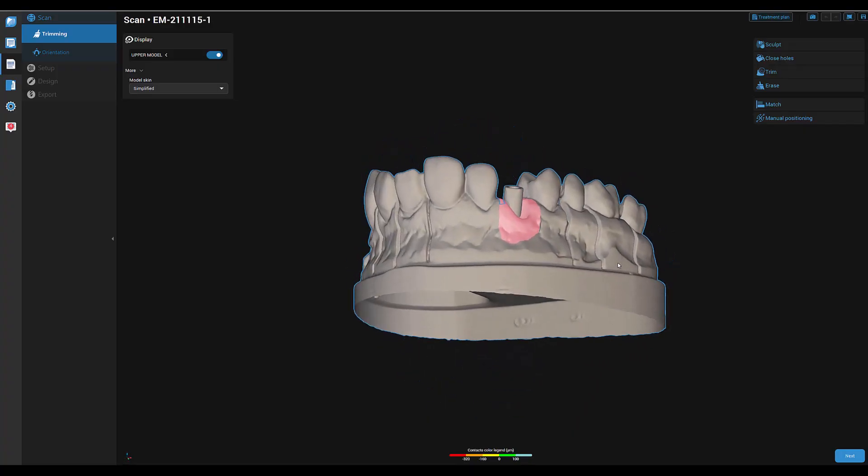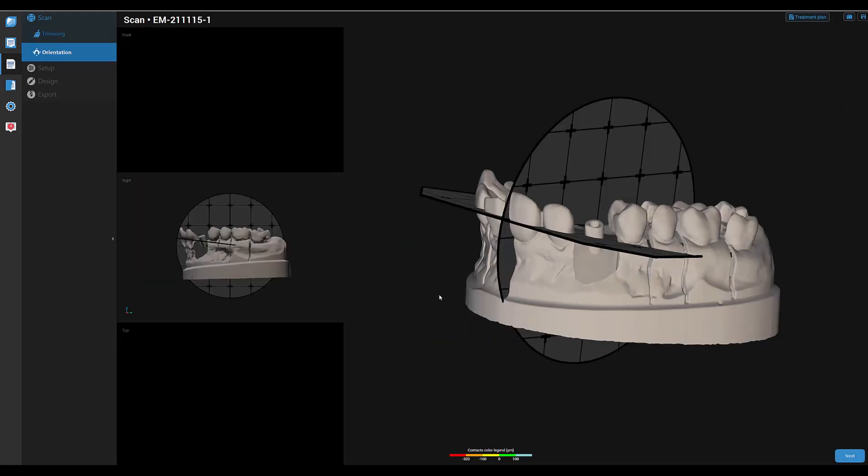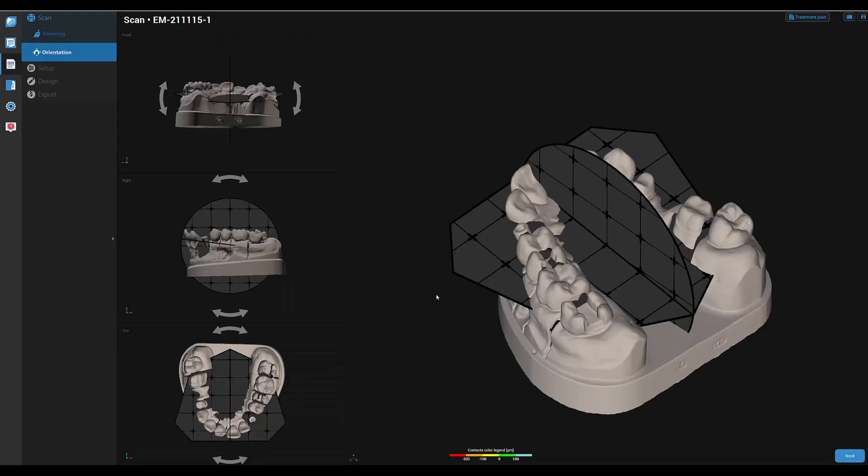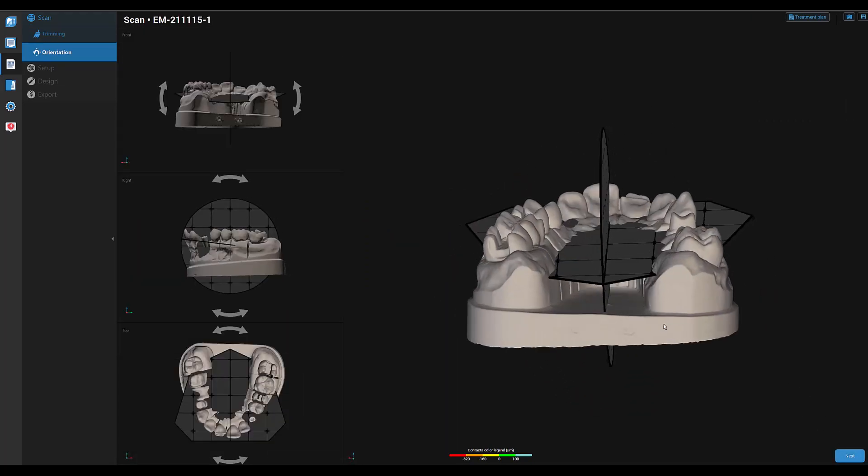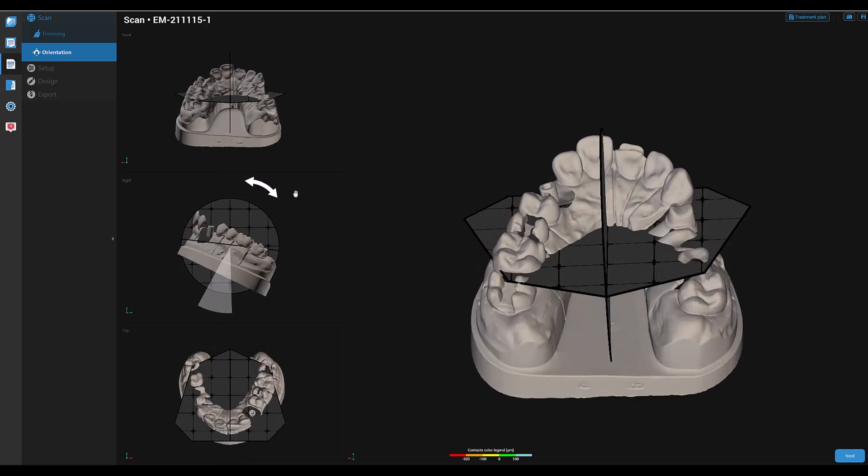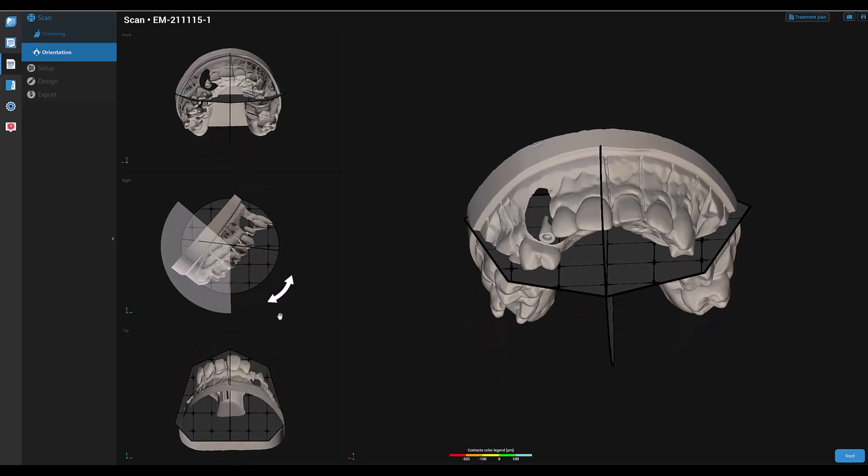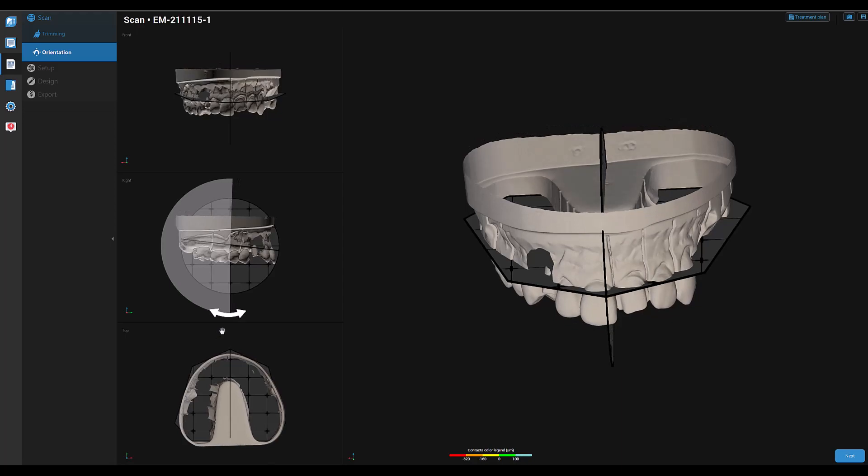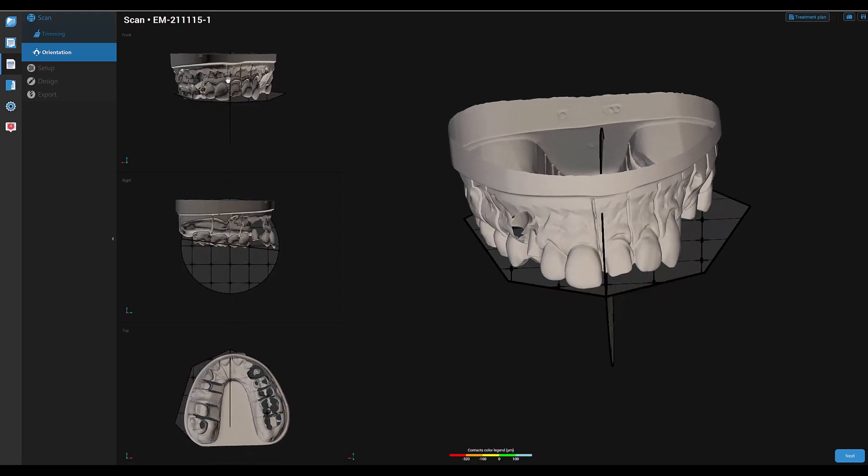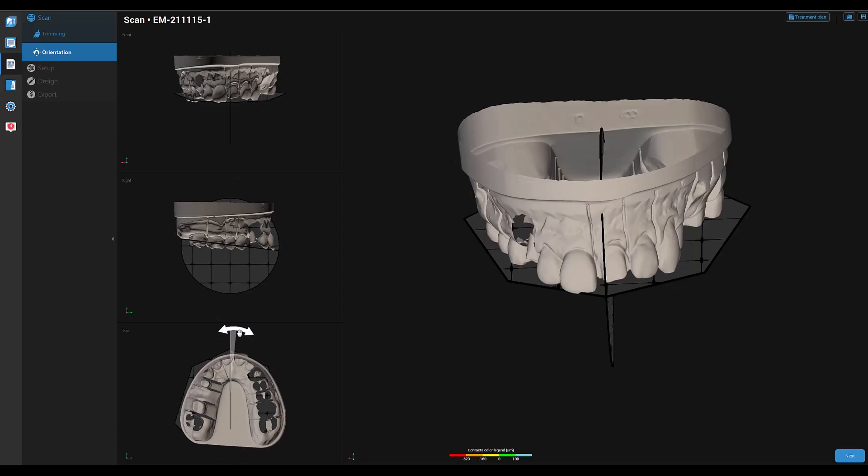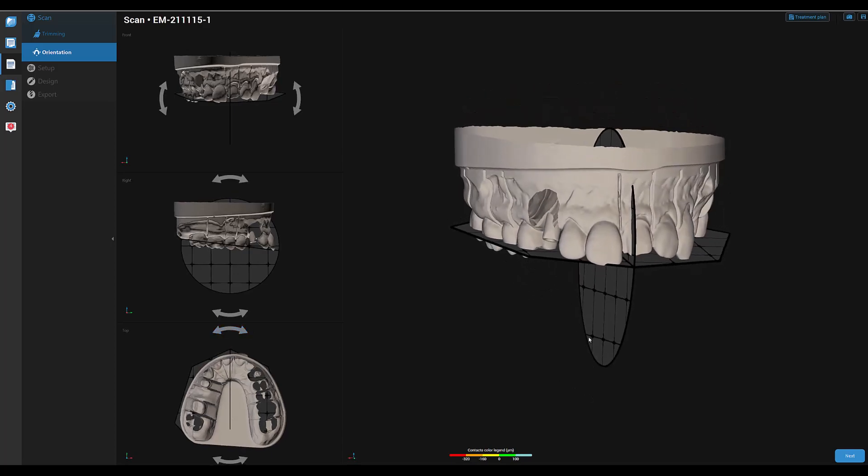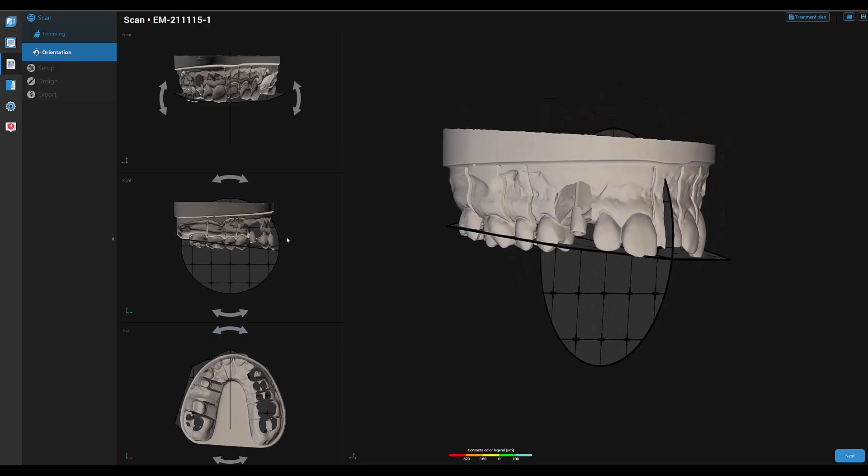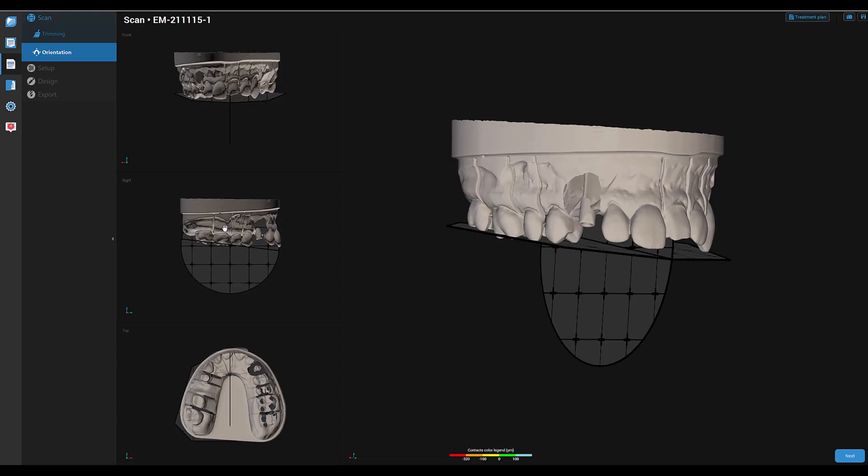After scanning, we start with the orientation. First, turn the model 180 degrees. Make sure that the center position is correct. The cusp should be positioned to the template as shown.